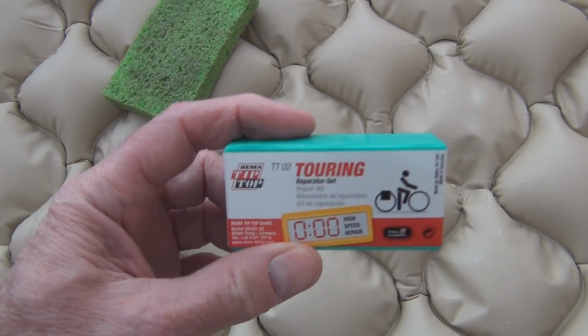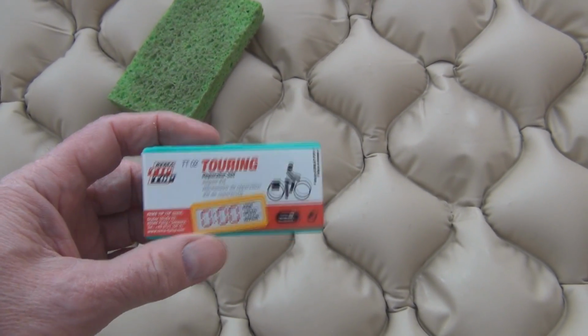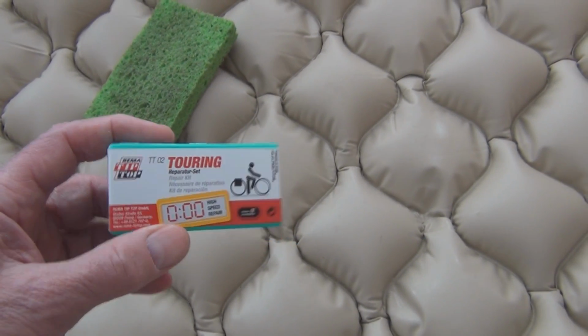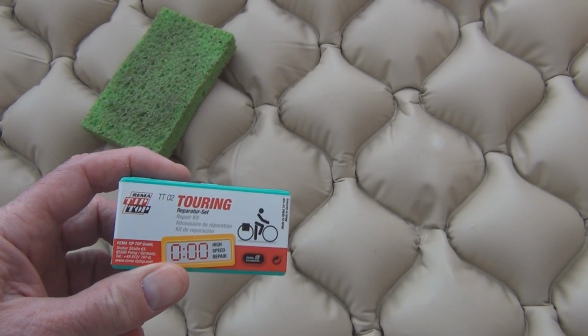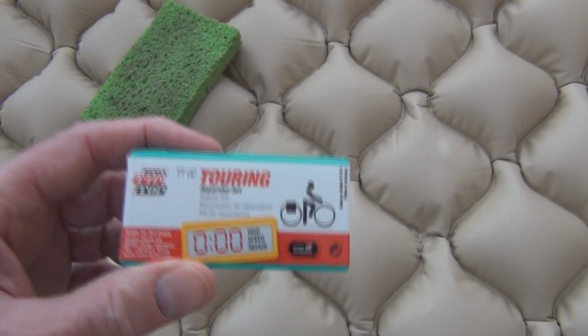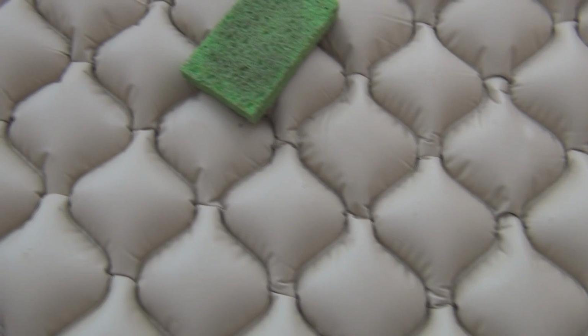One of the first things I was thinking about is getting a repair kit myself, and this was a waste of money here because initially I was thinking about a bicycle repair kit, but that's not what you need because this is vinyl. So they do have a Gorilla Tape, but it had mixed reviews, but they do have vinyl repair kits for inflatable mattresses, so those might work.